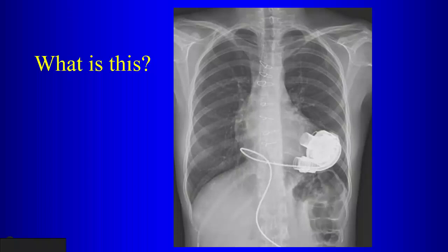Now, the reason you don't see these anymore is that if a patient has this, they're no longer considered a candidate for cardiac transplant. So it's called destination therapy. Destination is the ECU, eternal care unit.